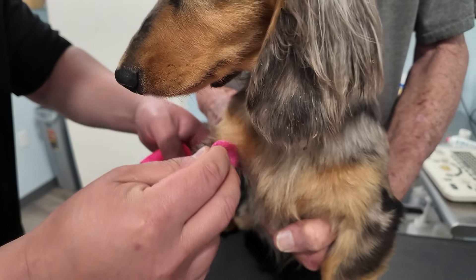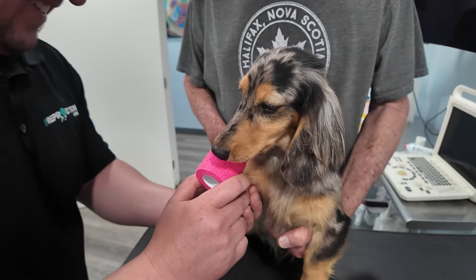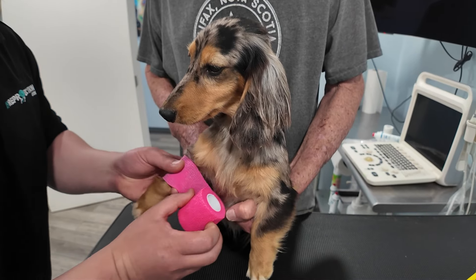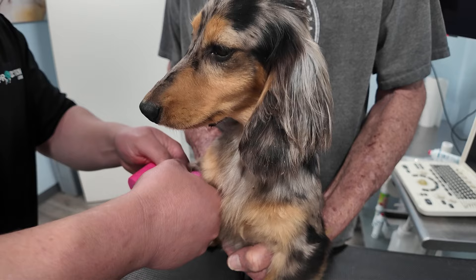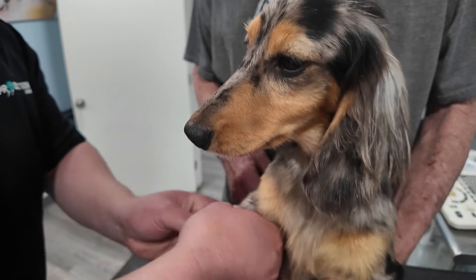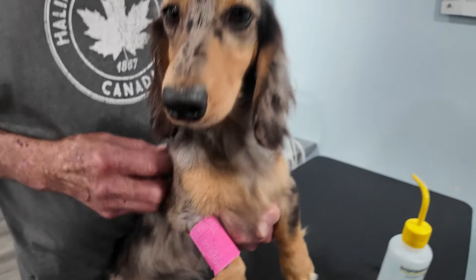Once the needle is in place, we gently draw the blood. After collecting the necessary sample, we apply VetRap to the injection site to prevent bleeding and ensure the area remains clean. This method ensures a safe and efficient blood draw, even in breeds with difficult veins.